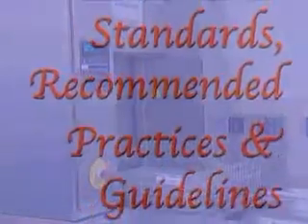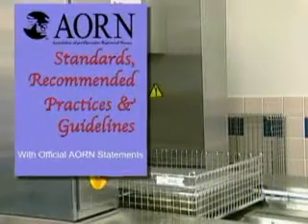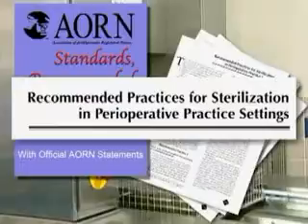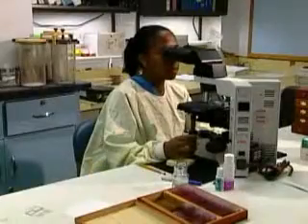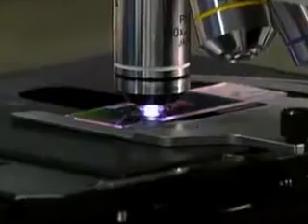As a means of preventing infection during any invasive procedure, AORN established recommended practices for basic aseptic technique and sterilization to serve as a guide for anyone who is either directly or indirectly involved with patient care. All personnel responsible and accountable for sterilizing items and handling sterile supplies must follow written policies and procedures. All basic procedures for cleaning, sterilizing, disinfecting, and maintaining the sterility of supplies are based on our knowledge of bacteria.